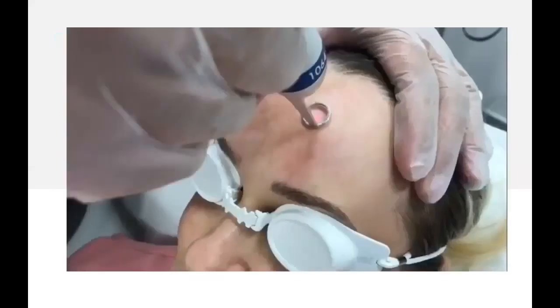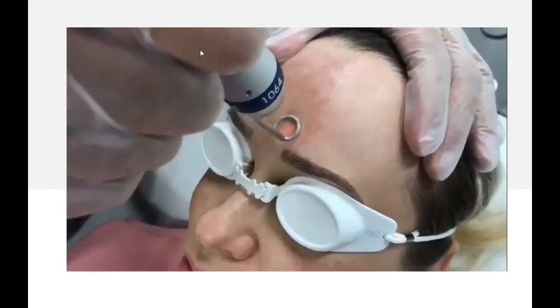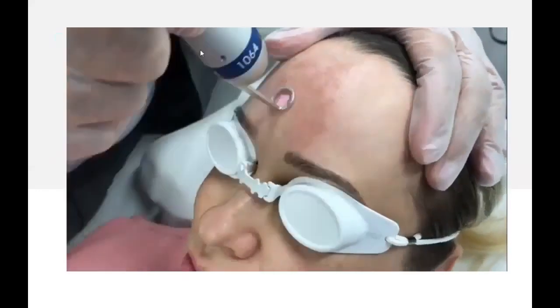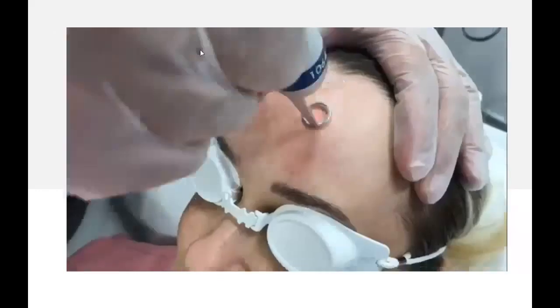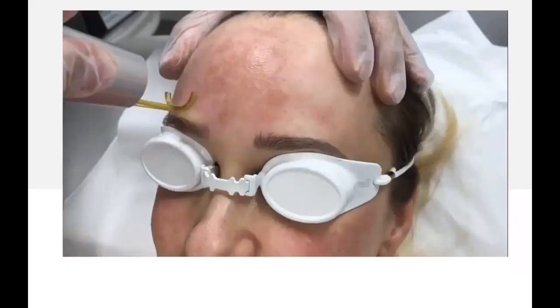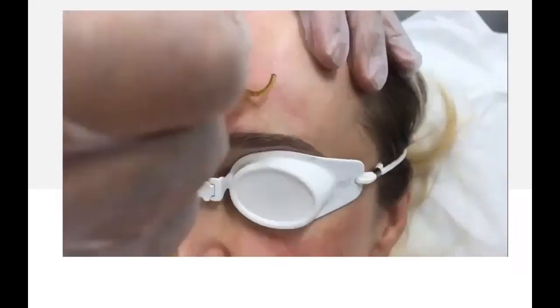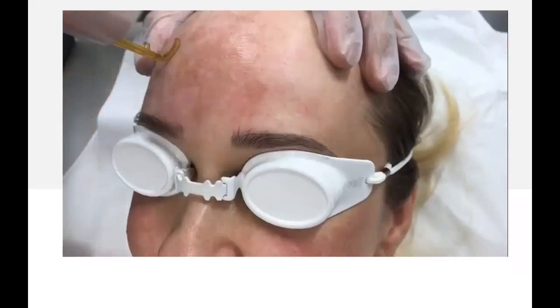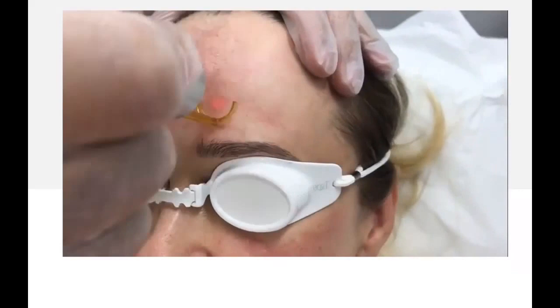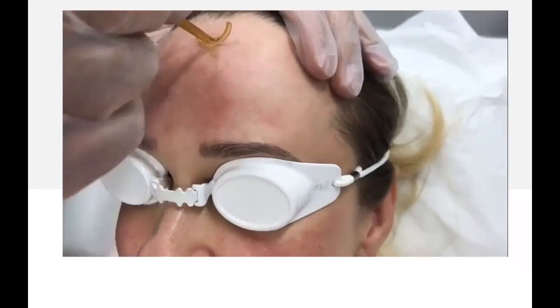This is just a short video to demonstrate how this works with the 1064 Resolve handpiece. So that would be the first. And then this would be followed by the large spot zoom, 1064. So that's a large spot, low fluence, 2 to maximum 4 passes with erythema as a clinical endpoint.